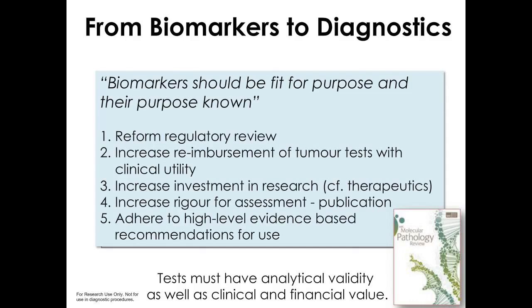And then, of course, ultimately, we need to adhere to a high-level evidence base if we're going to recommend the use of these biomarkers for making clinical decisions. And that really means that the tests have to have analytical validity as well as clinical value. And of course, they also are going to be required to have financial value if they're going to be brought to market.